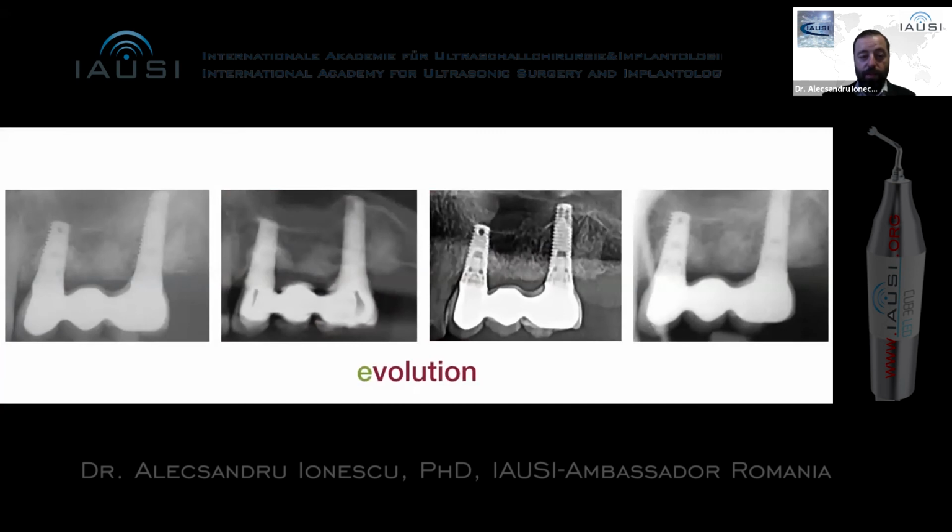So first is a retroalveolar X-ray. The second is from the CBCT scan. The third is from the panoramic X-ray, and the third is again of retroalveolar.